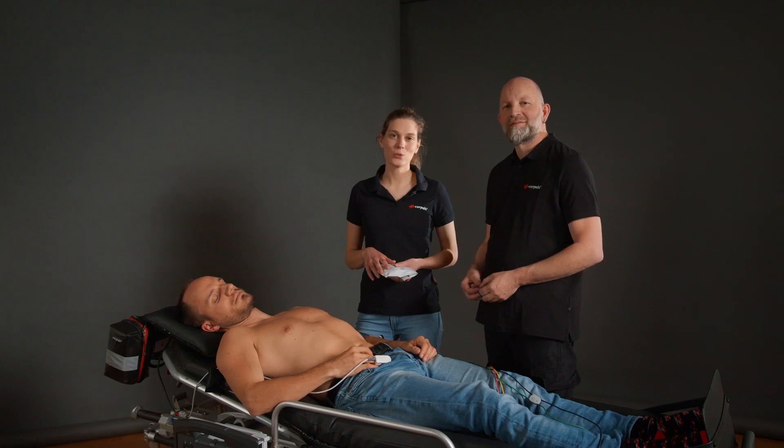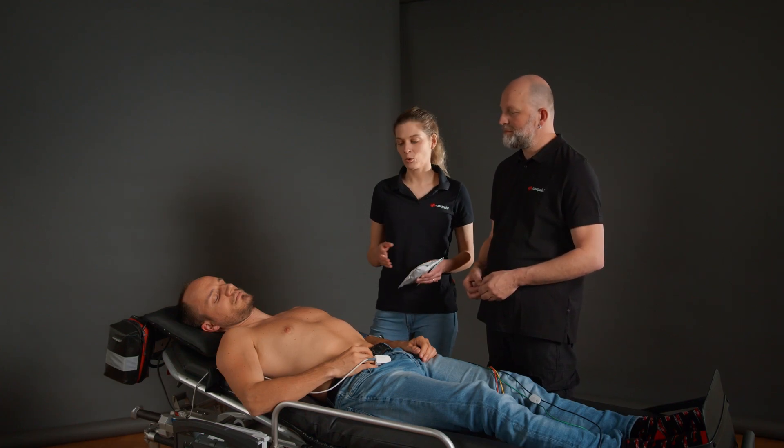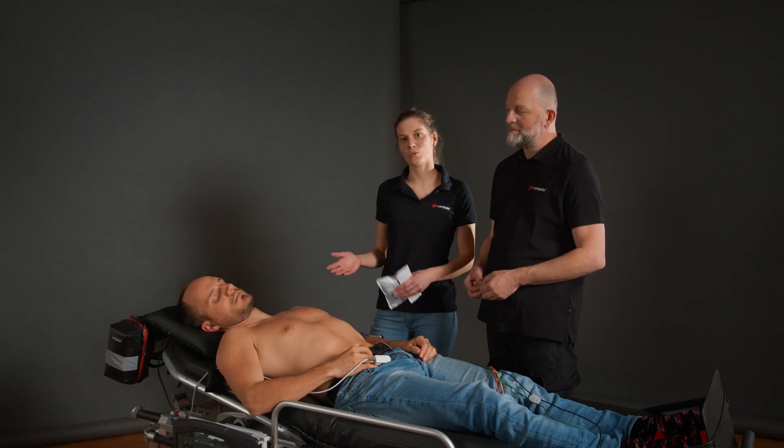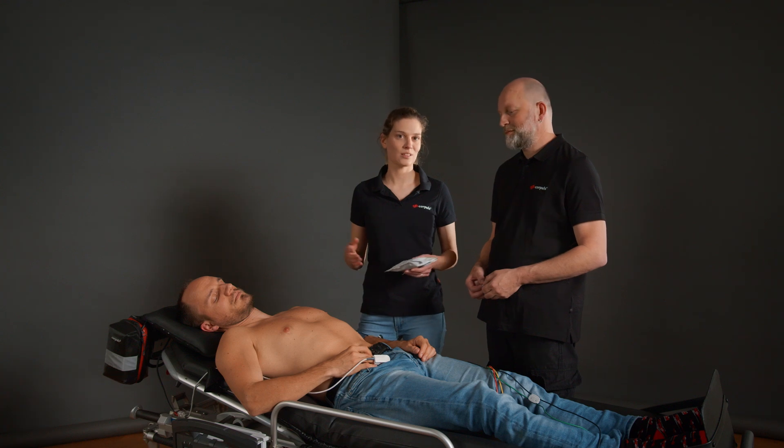We want to show you how to set up a diagnostic ECG and have already prepared the patient accordingly. The upper body is completely undressed and in a slightly elevated position. The chest is also completely dry and clean and there is no need to shave it.